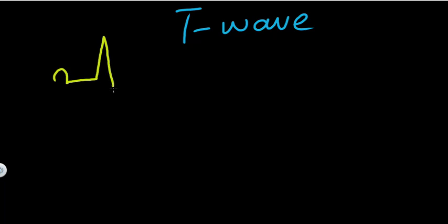Now we have this T wave, which is quite important, being the last one. We have covered almost everyone.